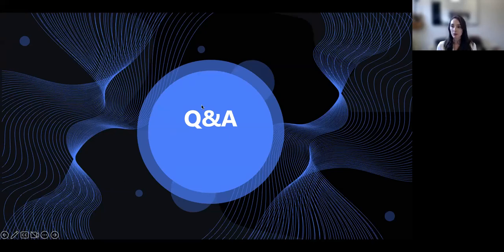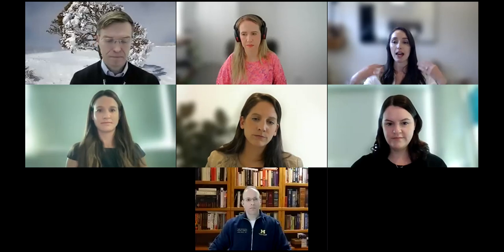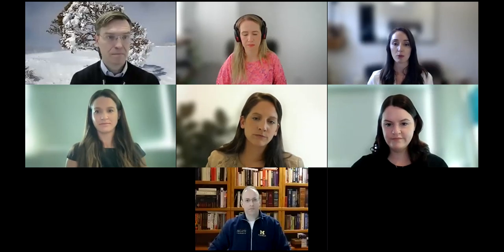We need to be considering with this speech approach adequate ventilation, loss of PEEP and lung de-recruitment. And so when we're working with this speech approach, and Hannah can jump in here, we're working with our physio colleagues to make some ventilator setting adjustments to compensate for that leak, and also looking at laryngeal control, and modulating that airflow so that we don't have significant leak of air through the upper airway.